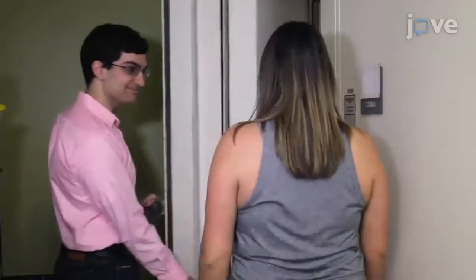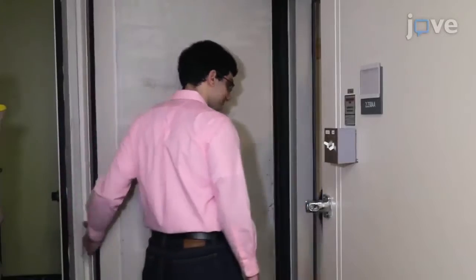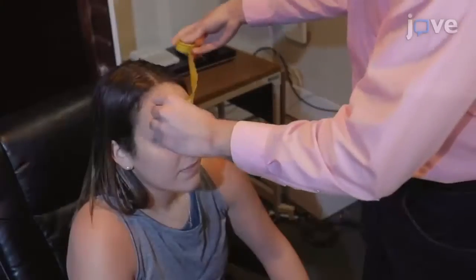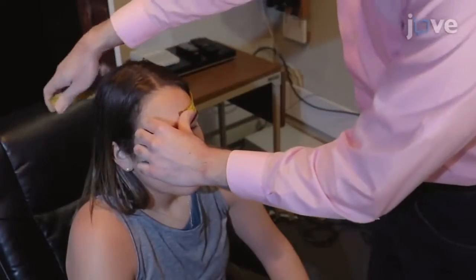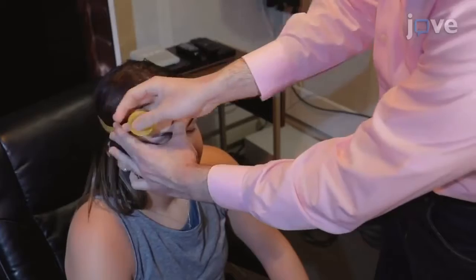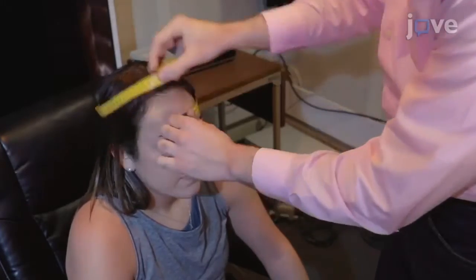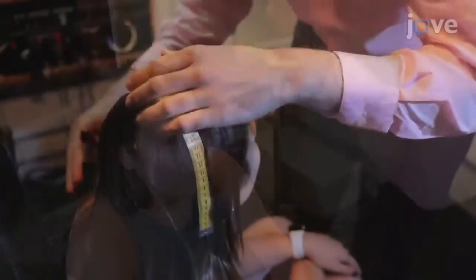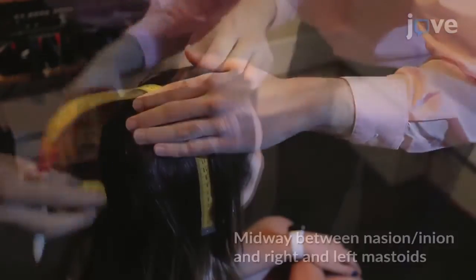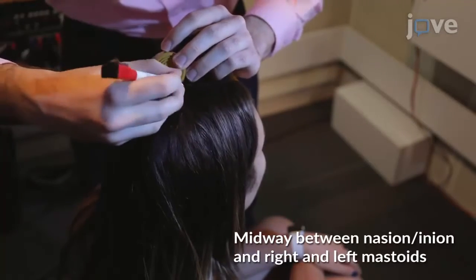After escorting the participant into the EEG recording room, measure the head circumference of the participant in centimeters and select the appropriate EEG net size. Measure and mark the midpoint of the scalp for the placement of the reference electrode.